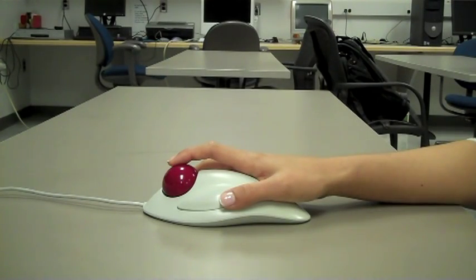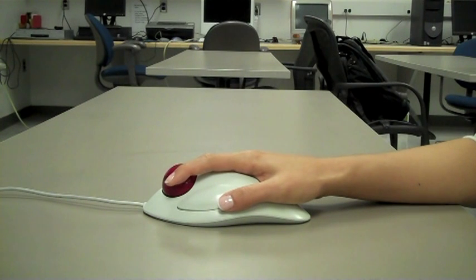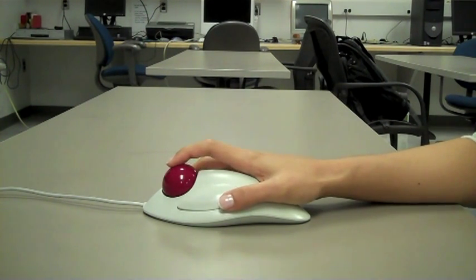Now let's have her navigate the trackball with her index finger. Notice the movements are the same as the thumb trackball mouse.